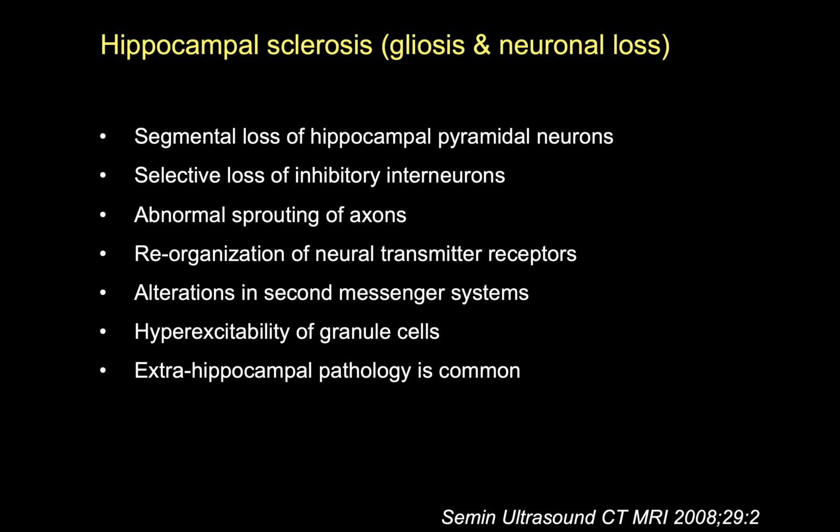And generally T1 weighted images, because gray matter is gray and white matter is white, it's a nice sequence to look at the structure of the brain, and a nice one to be used to look at volume loss. And you can actually do volumetric studies in a kind of semi-automated way to make calculations about how much atrophy there is. And this is done not only in epilepsy, but in cognitive behavioral neurology as well.